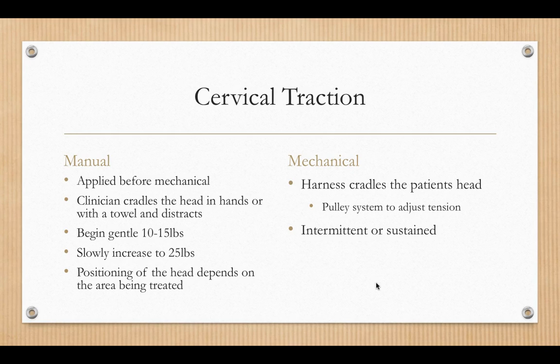You want to make sure throughout this whole process you keep asking your patient if they have any sort of discomfort. If any of their symptoms increase, we stop the treatment. If our hand placement is bothering them, we adjust our hand placement. You just want to make sure that they don't get dizzy or anything like that too. Think about your contraindications as well before we apply this.